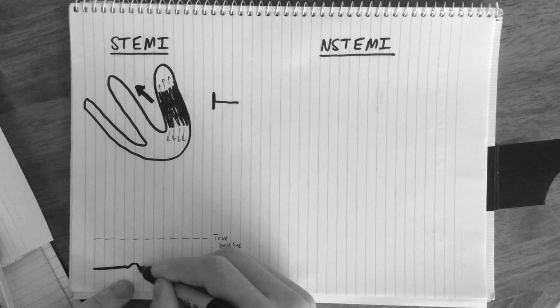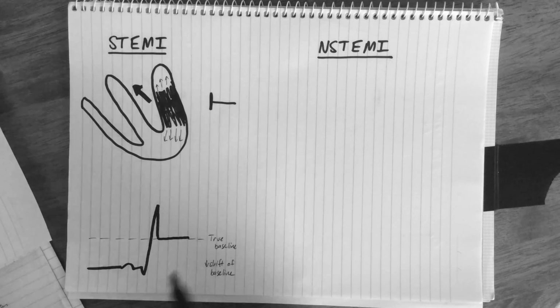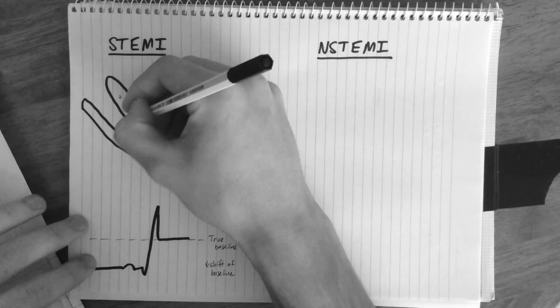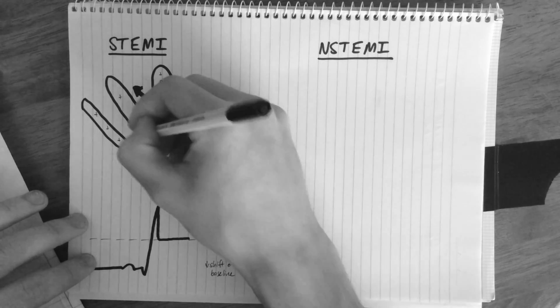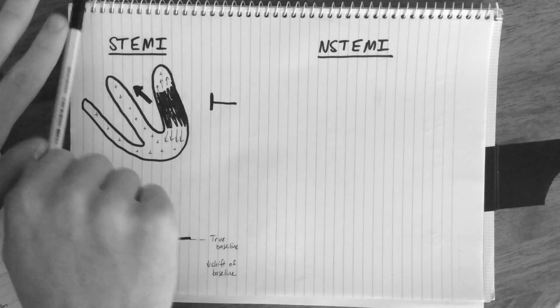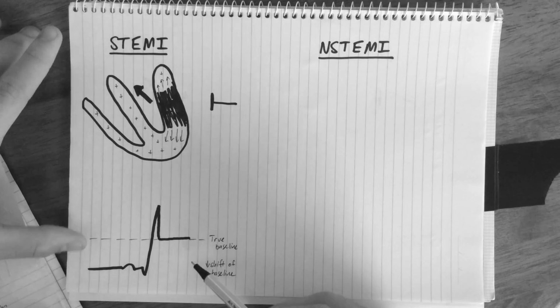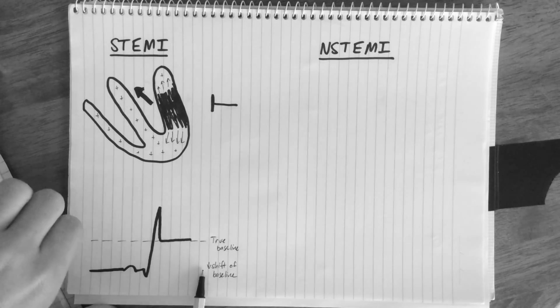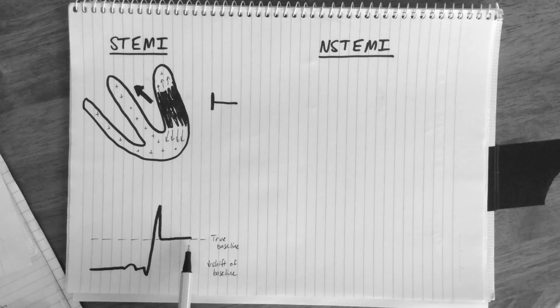So, P wave, QRS complex, everything seems normal until we get to the ST segment. It will be elevated. The reason for this is that after the QRS complex and before the T wave, the ventricles are completely depolarized. So I'm drawing pluses here to reflect the positive membrane potential of the cardiomyocytes. Normally, this would be read as a voltage of 0 because there is no difference in voltage across the myocardium. If the baseline was at true 0, we would see the ST segment return to the isoelectric line. But because our baseline has abnormally been shifted downwards, the ST segment, which reflects a true voltage of 0, appears elevated.